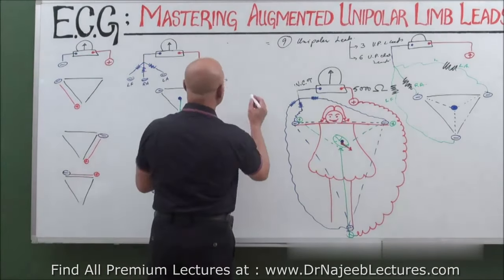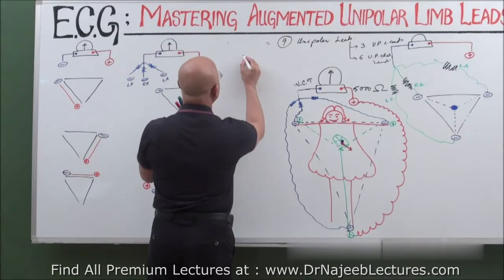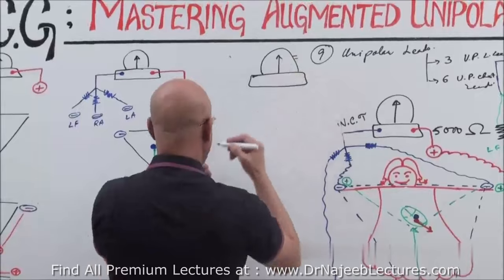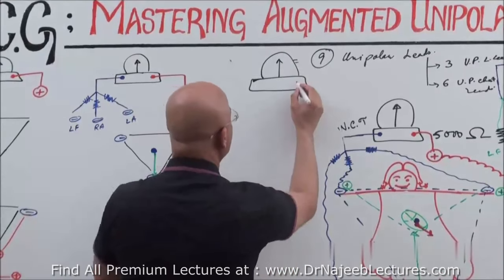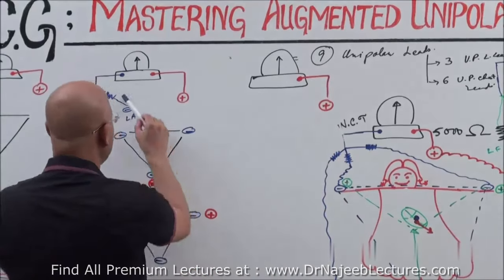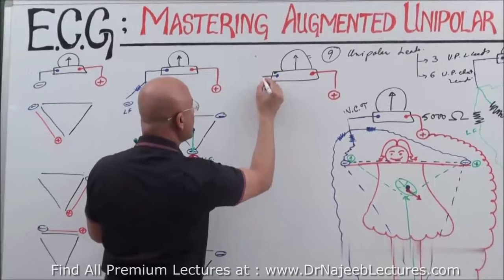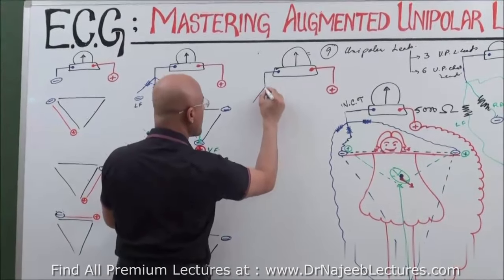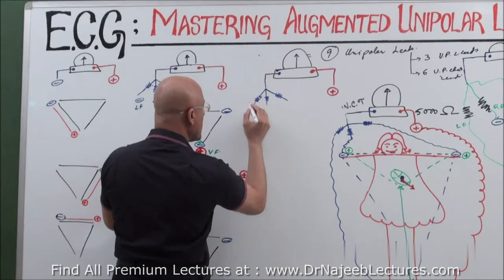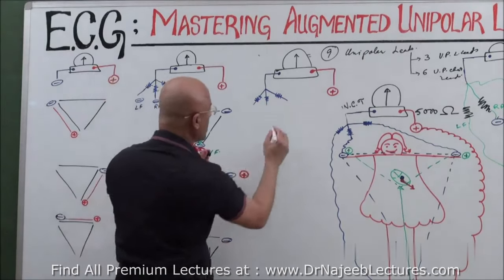Yes. So then Goldberger came with this idea. I will make these modified Wilson's, or modified unipolar leads. This positive electrode, or exploring electrode, is the same, right? He modified Wilson. What he was doing, Wilson, even though it was having the three ends, right? What he was doing, now listen carefully and compare this with what I'm going to draw.